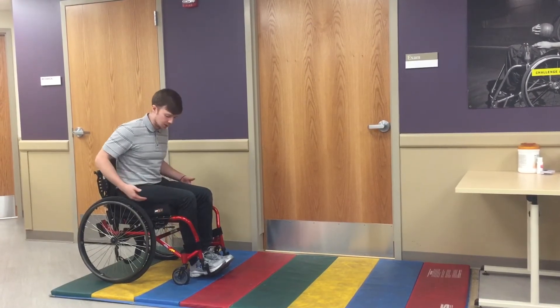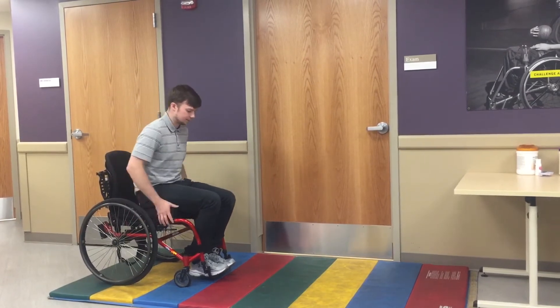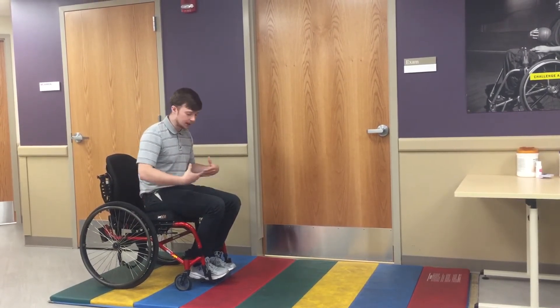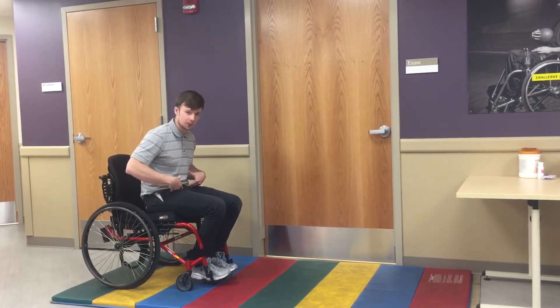The first thing we need to do is scoot forward towards the edge of the chair. If your patients have a little bit more dump in their wheelchair, this is going to be a little bit harder to execute, and also when it comes time to bend forward they are going to need a bit more hip flexion, so just be on the lookout for that.